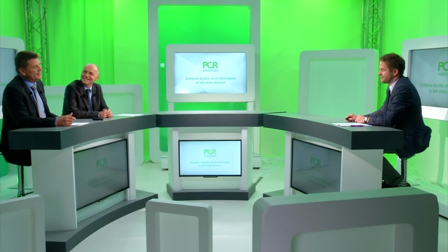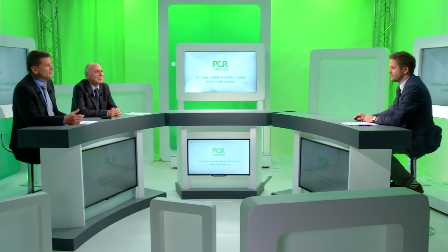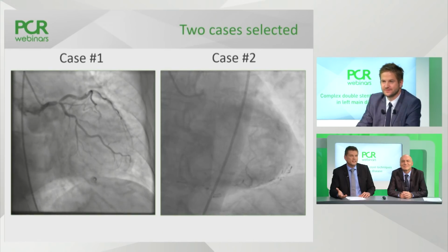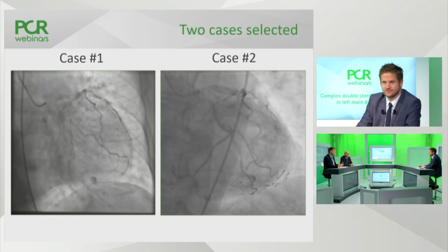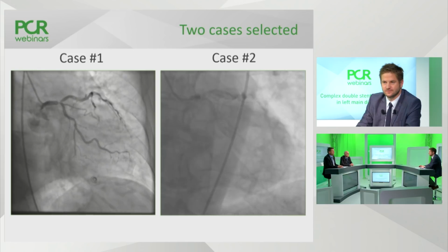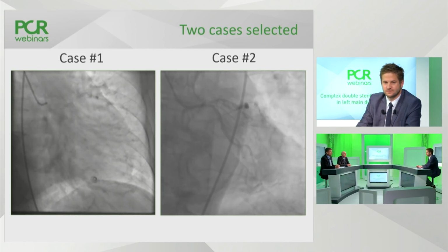Yeah, Gabor, I think the first thing we should have in mind is that this is an angiogram and not a patient. So I think we always need to integrate the patient and his history, the clinical issues of this patient. We need to look at the anatomy for sure, which is very important. And I also think it would be very good to think of the own experience we have. So understanding this recommendation, I ask immediately Marko to present these cases.